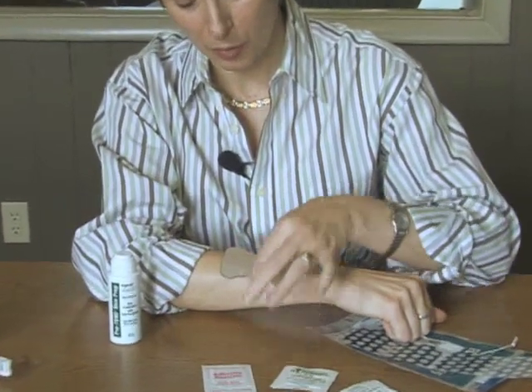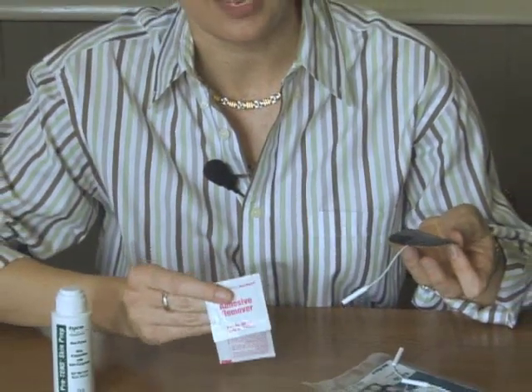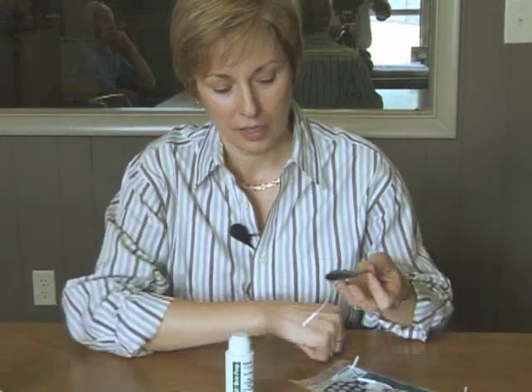Once you're ready to remove your electrode, again, you're going to want to pull it up from a corner, not pulling from the wire, and simply remove it. And you can use this adhesive remover on your skin afterwards if you've used one of these preparations beforehand to completely get that coating off of your skin.